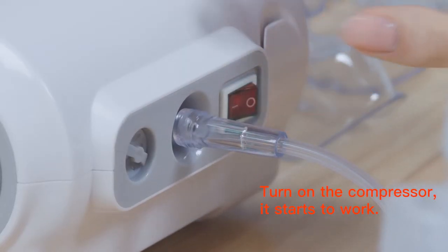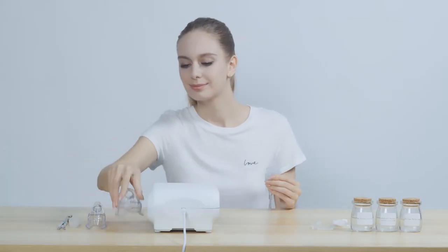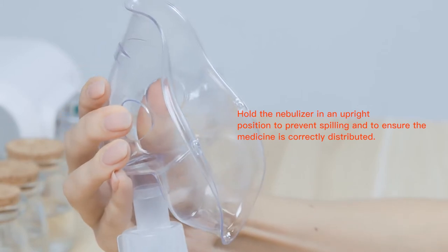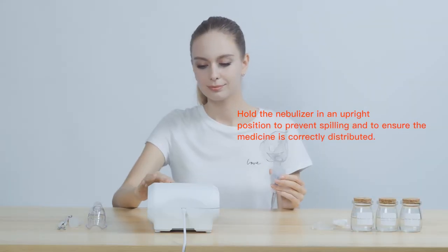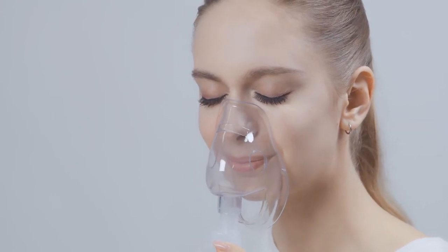Turn on the compressor and it starts to work. Hold the nebulizer in an upright position to prevent spilling and to ensure the medicine is evenly distributed. Take care.